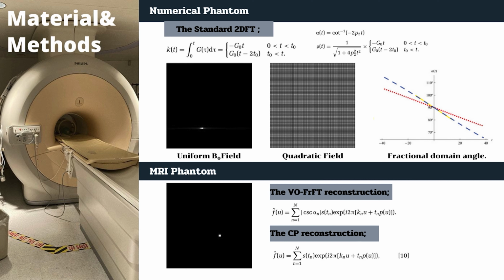The purpose of the experiment is, first, to investigate the process of decoding an image from the MR signal. Secondly, it seeks to validate the effectiveness of the field inhomogeneity correction algorithm. This study utilized a Philips 1.5 Tesla scanner with linear imaging gradients for acquisition.